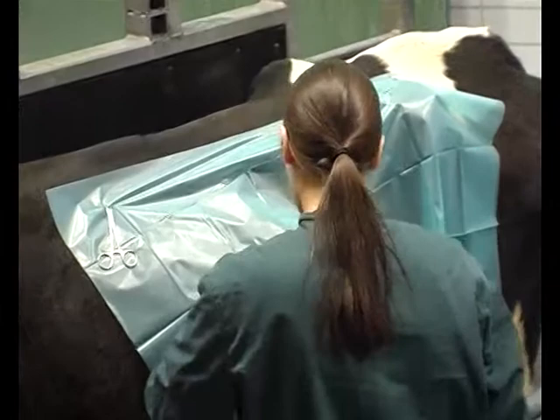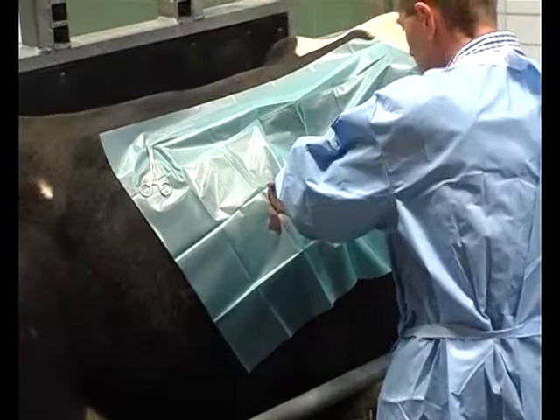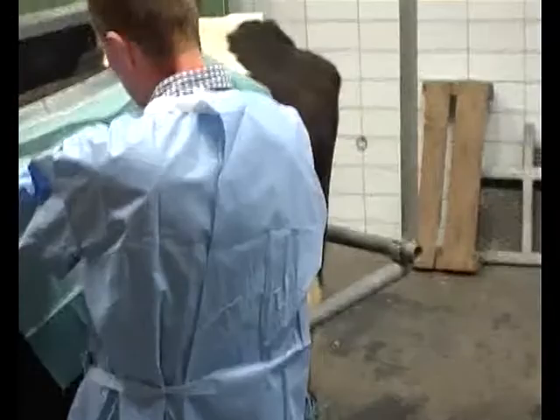Have you got the other applicator from Christiansen as well? Okay, it's the same like Heinz. This is a small incision. And this is a bit bigger because we have to bring in the trocar to pass the Christiansen applicator. This is a little bit bigger.